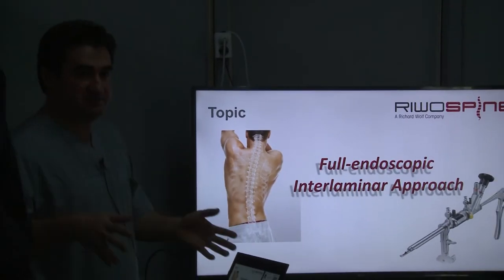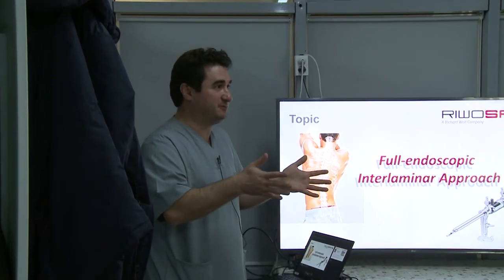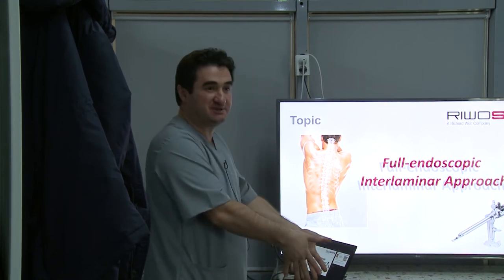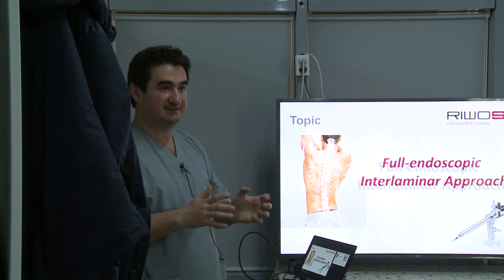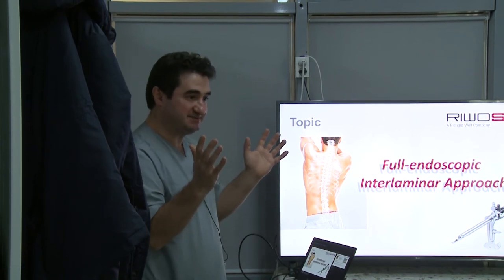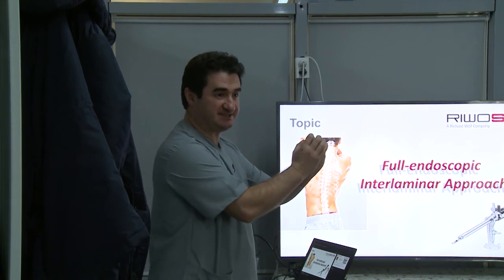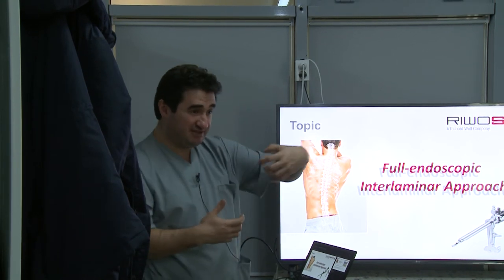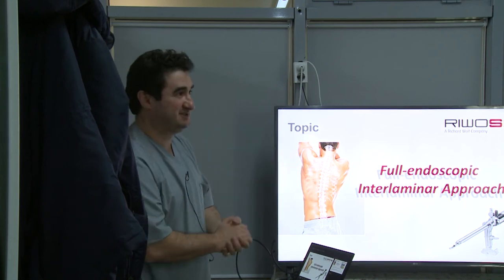We know the approach. You've seen the case in the morning. You know what is there. It's familiar to you, the same approach with the microscope. But the challenging part is the handling. With the transforaminal approach, the anatomy is different for us, the approach is different, but the system is fixed there. You don't need to hold it. But with the interlaminar, you need to control everything. But you know the anatomy.